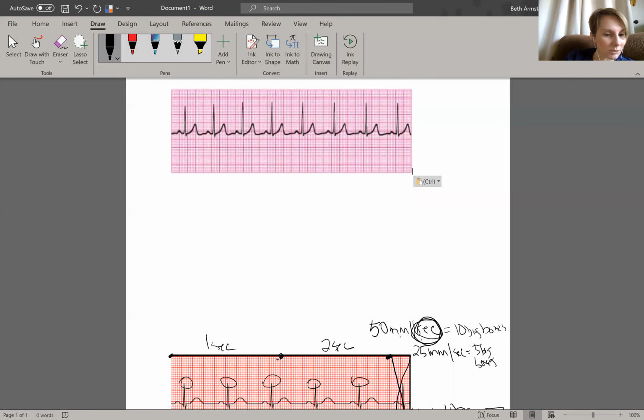Number 5 you struggled with. Ventricular premature contraction. Okay. Oh, because I asked what a VPC was. I wasn't sure. Got it. Yeah, I can show you what that looks like too. So that's something where I'm still not sure of identifying what's what.